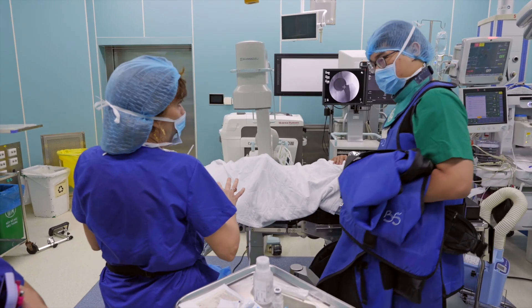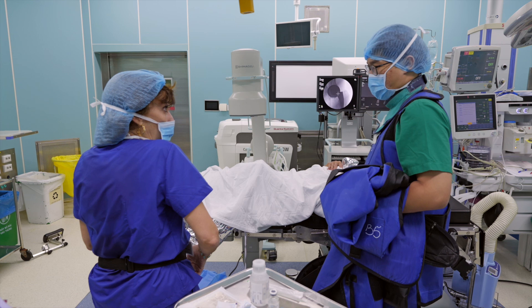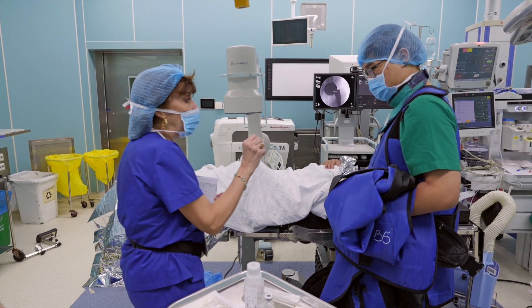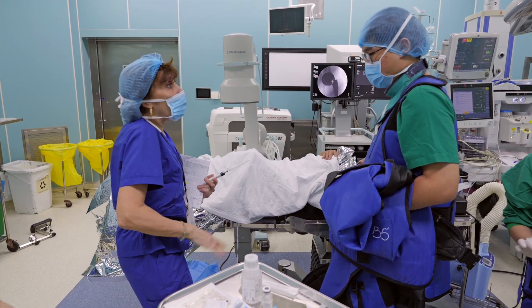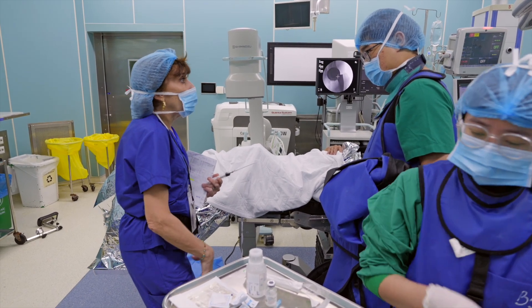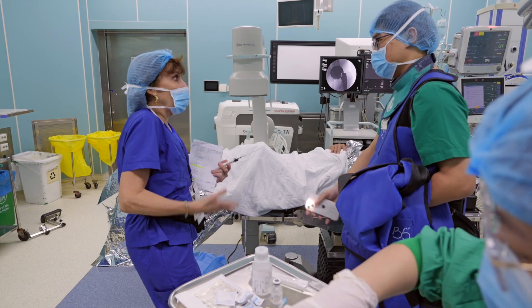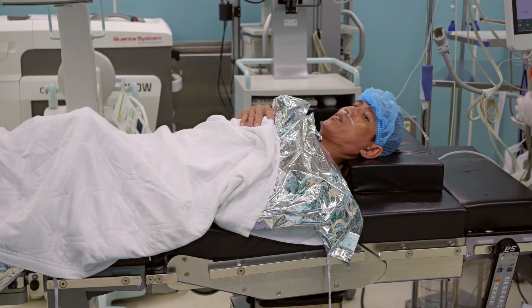If you do it with the patient lying down, you have to worry about the femoral artery and all the structures in that area. When you give lidocaine, it tends to spread around the nerve, and if it gets around the femoral nerve, they can get femoral nerve paralysis for a few hours — they can't walk, it scares everybody, even though it goes away. This anterolateral approach avoids that problem entirely.